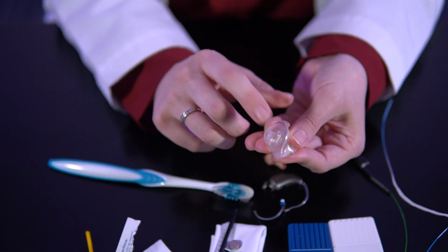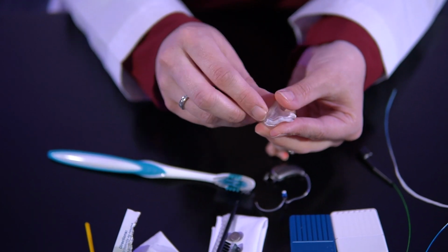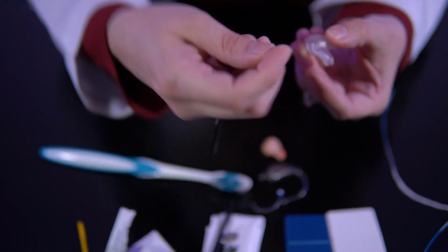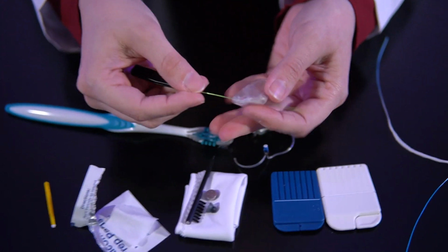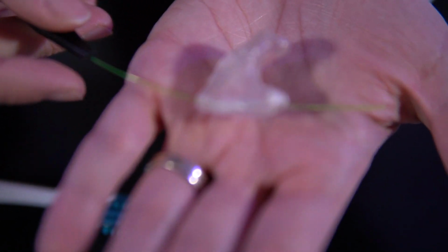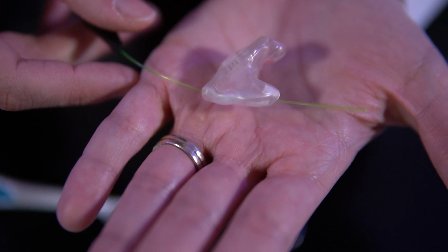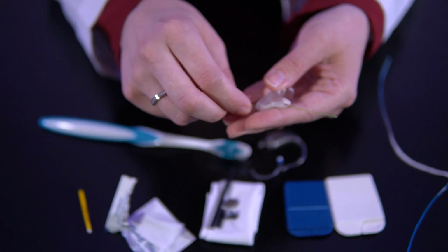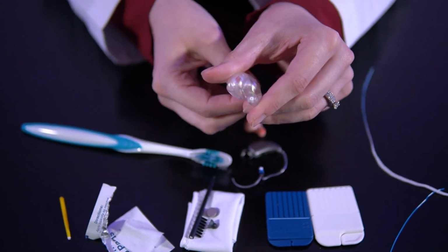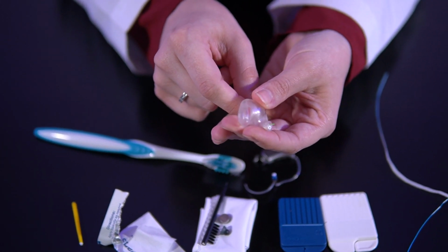The only other thing on the custom pieces that you'll need to do is a lot of them have what's called a vent, and that vent runs through the bottom of the hearing aid, okay? So see, we've got that there. That vent will get plugged up with wax, okay? And if it gets plugged up with wax, a lot of times you'll feel plugged up in your ears. So use fishing wire, some kind of twine, something just to push the wax through on that, okay? And that's all you have to do on that part.